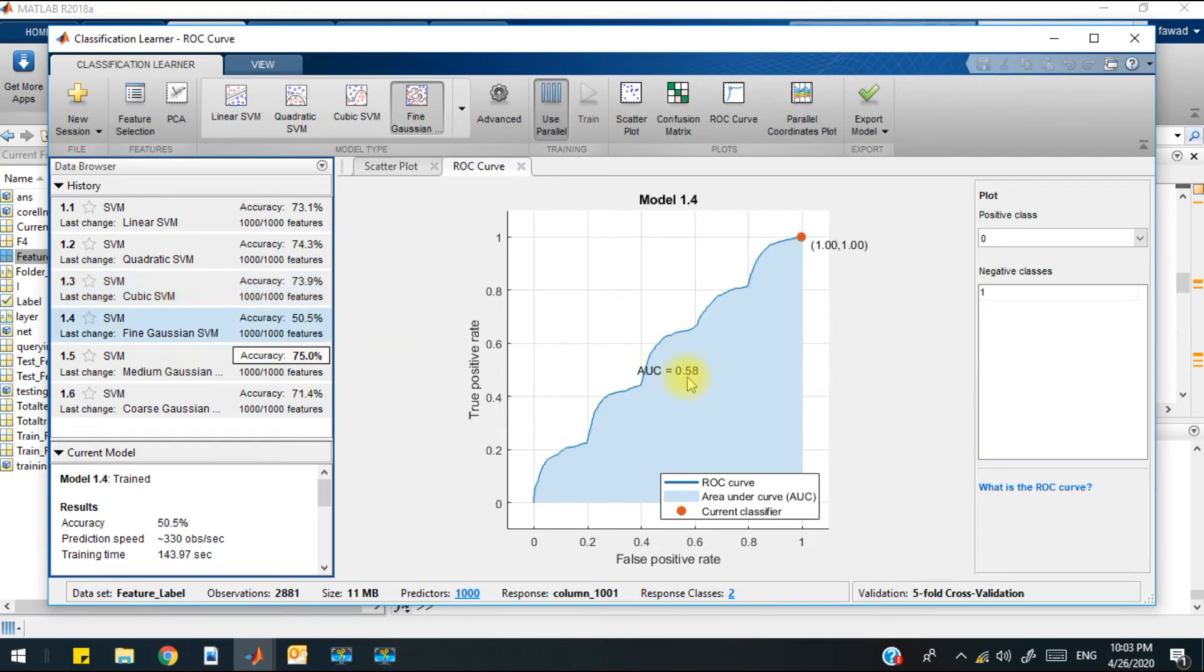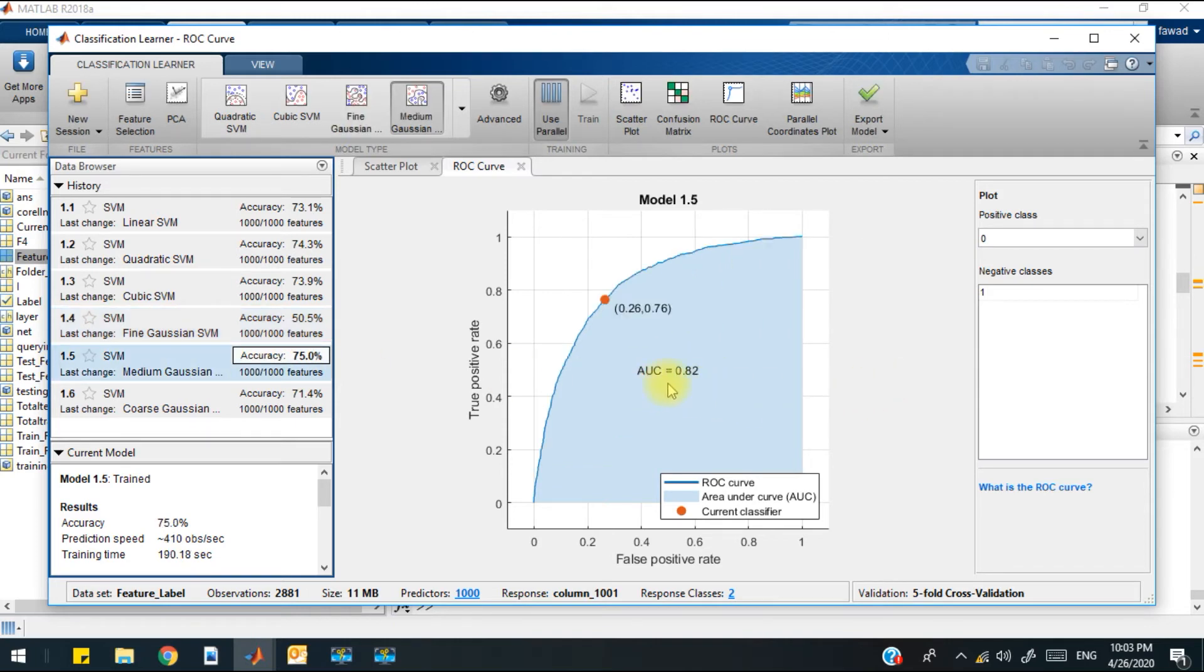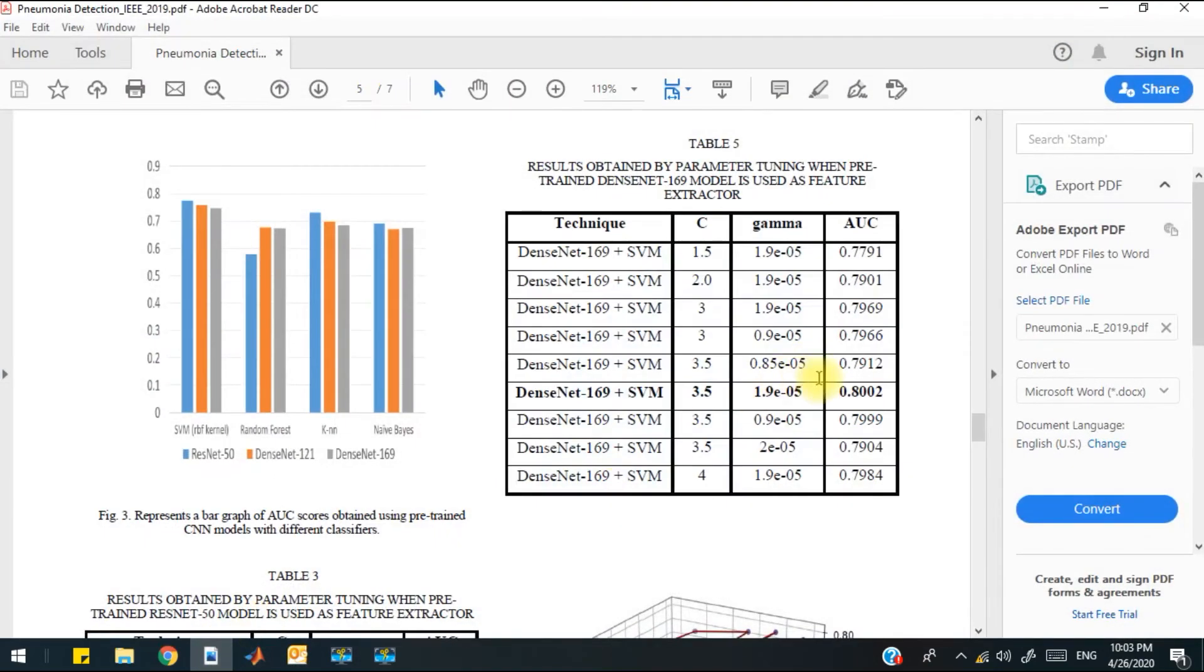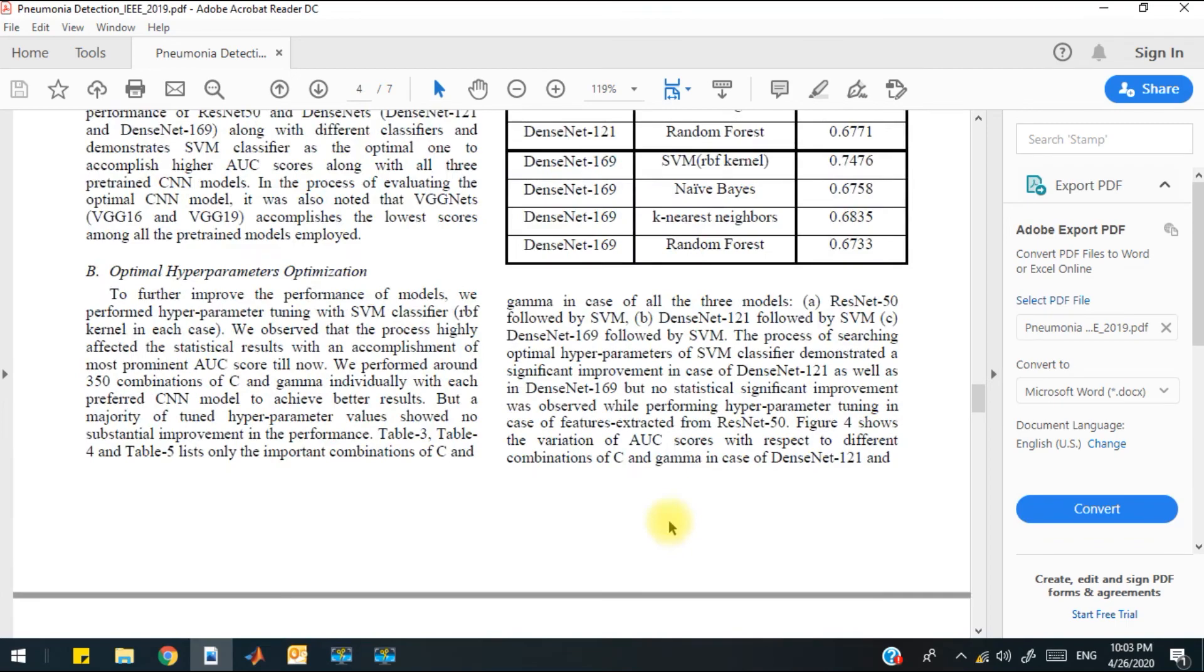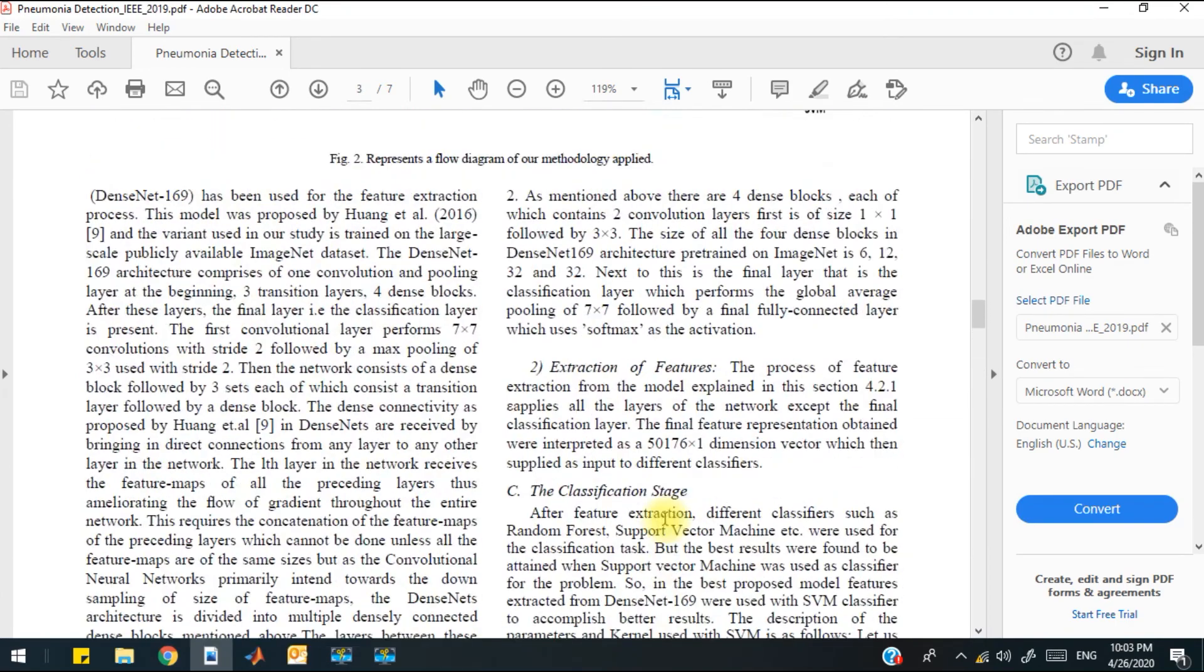With fine Gaussian SVM, the value is 0.5, which is lower. With medium Gaussian, the AUC value is greater than all the other kernel values. The AUC value for medium Gaussian kernel is 0.82, which is much higher than the provided paper.